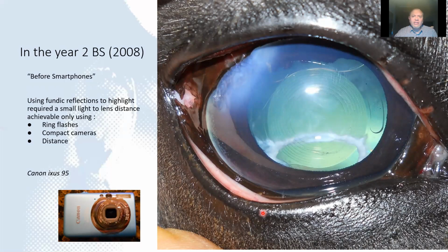So this is a horse who's had cataract surgery. This is the intraocular lens in place. This white area here is outlining the lens capsule rupture. This was a posterior lens capsule rupture we see not uncommonly in young horses as a cause of sudden onset cataract. And we can see the edema adjacent to the corneal sutures just at the top there.